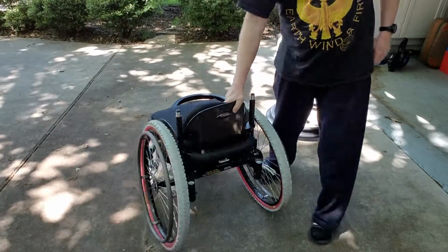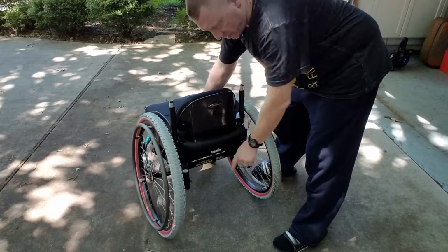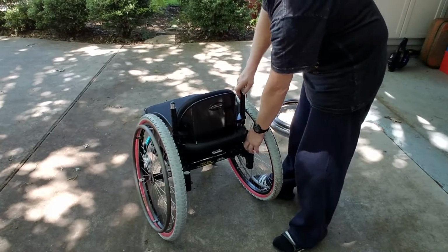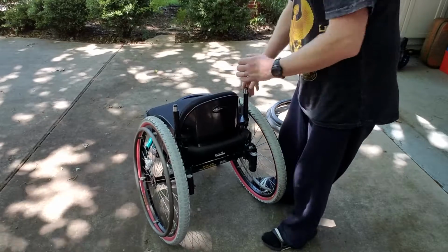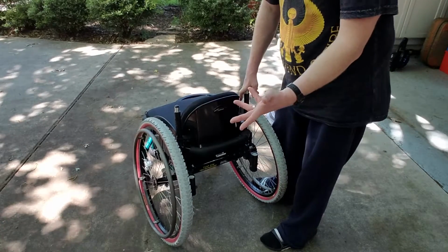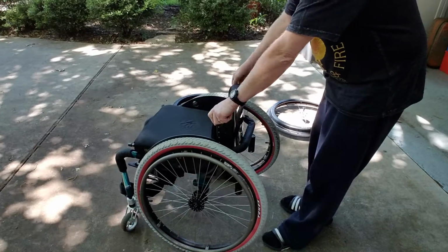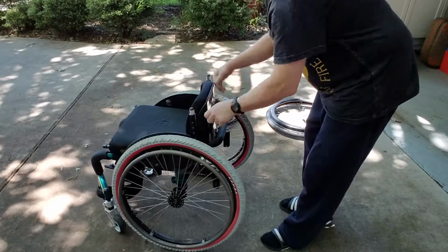A couple other things to note about this chair. It does have some connectors here where you can attach, I believe they make tubes that you can slide in here, and it's got little pins to hold them in place that you could use if you were to push somebody in this chair, more like a traditional wheelchair. We don't have those. And so whenever I was pushing Patrice around, I would kind of have to hold on to these things right here or this. It was sort of awkward.